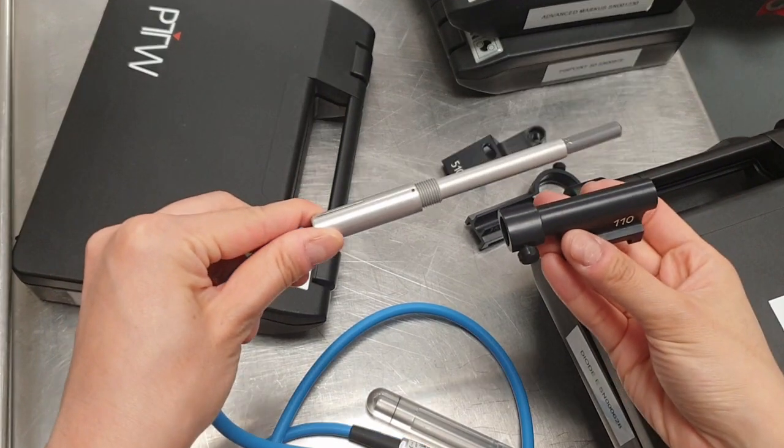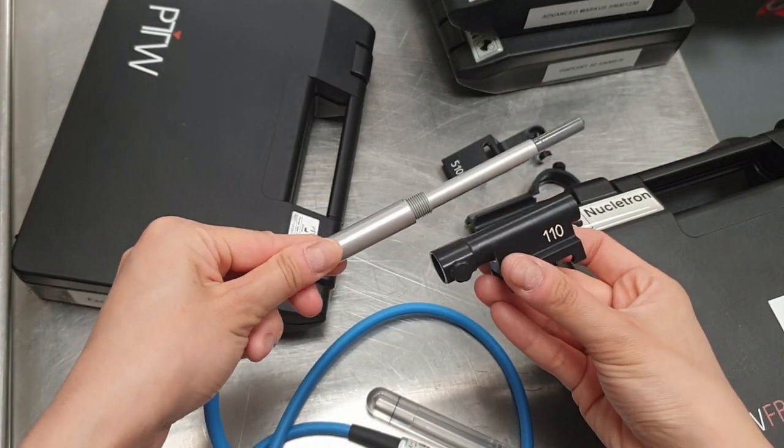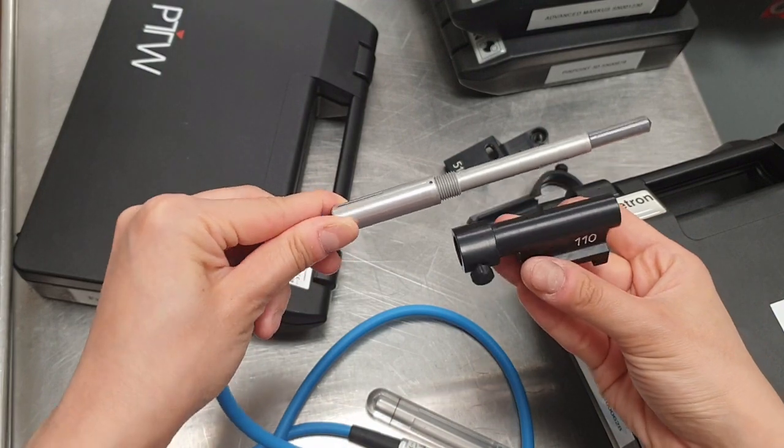For this practical, we have the detector mounted horizontally in a water phantom system, with the central axis of the detector set up as a reference point.